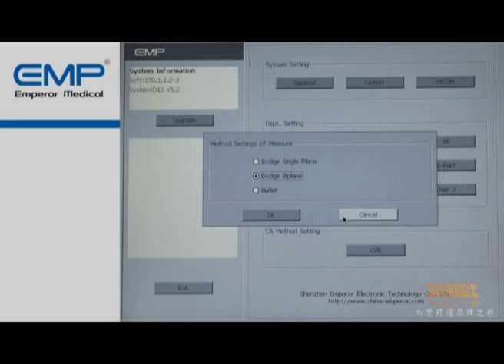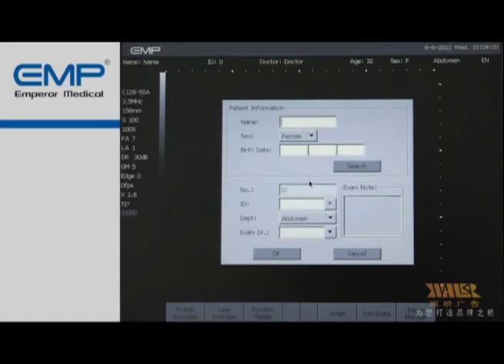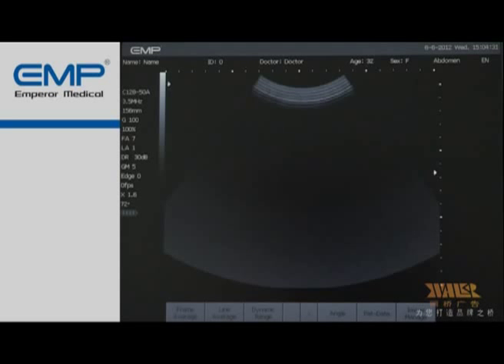Before ultrasound examining, the new patient information must be input correctly, so that the image operation, measurement, and report can be processed properly. Otherwise, the image, measurement, and report will probably be mixed with former patients, and all the examined information may not even be saved. Press the New Patient button to build the new patient information.